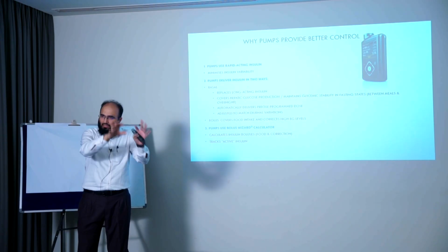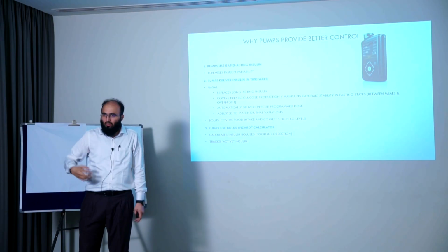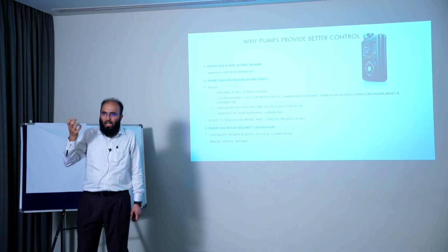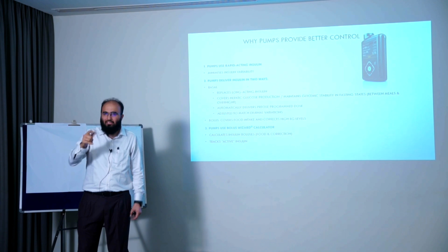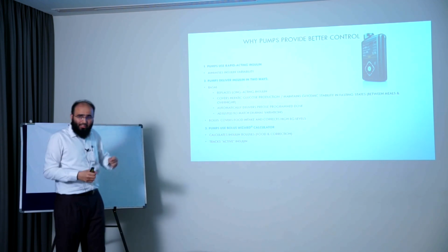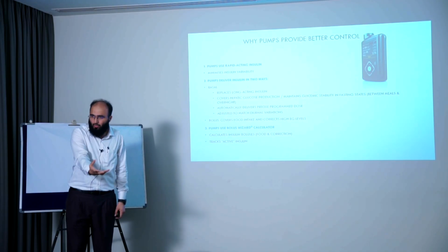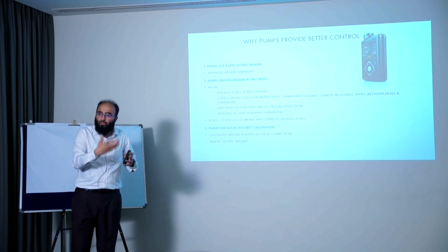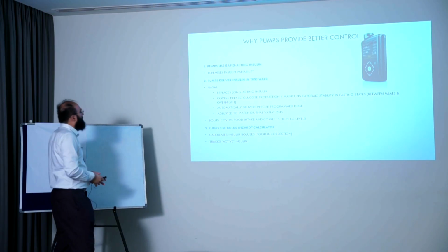Ultimately, insulin in the blood is going to behave like any insulin, like a regular insulin. But how the depot behaves when it goes into your subcutaneous space is what makes them longer acting, intermediate acting, or short acting, right? Here you are controlling the rate at which this rapid acting insulin is delivered, so that it actually acts like a basal insulin. So you don't need a basal insulin for these patients on a pump.